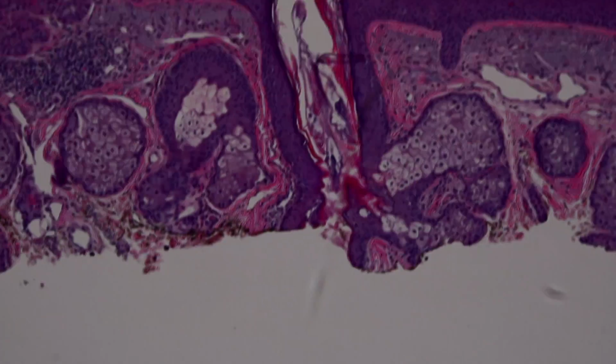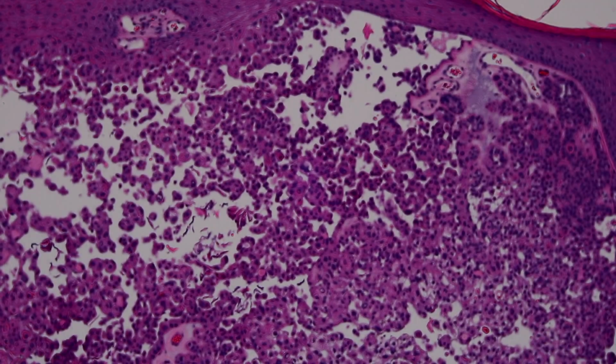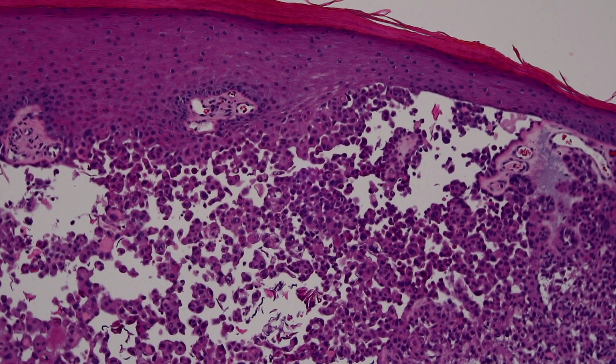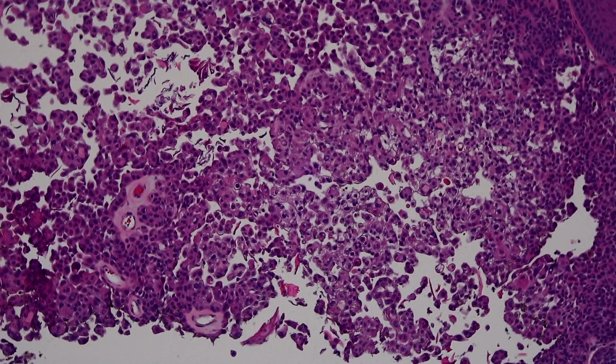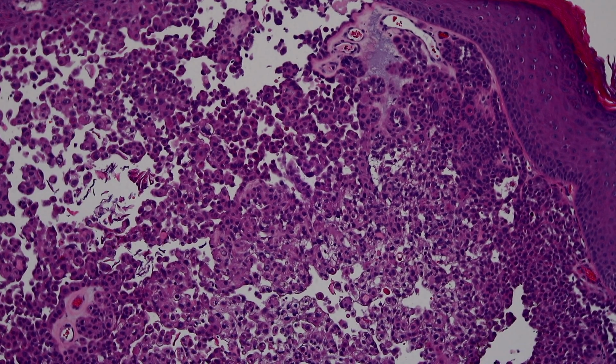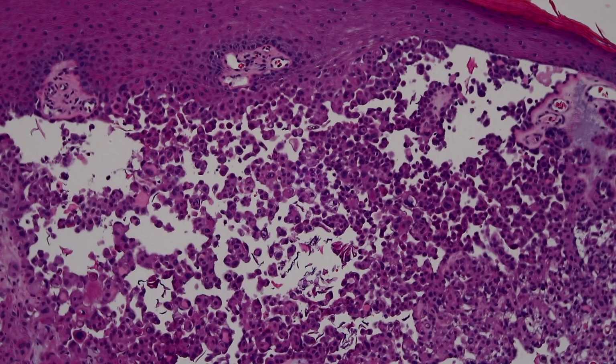squamous cell carcinoma. And just know that they can sometimes mimic other things outside of that look. They can sometimes mimic adenocarcinoma and angiosarcoma if you're not familiar with them. And if you're having trouble, immunostains can easily tell this apart because this would be positive for P63 or P40, and also for cytokeratin 5/6, which wouldn't usually stain an adenocarcinoma and certainly wouldn't stain an angiosarcoma.